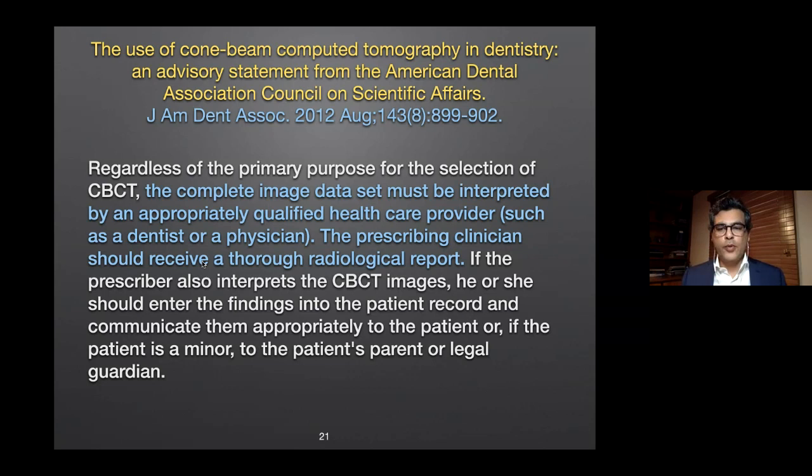So this whole thing needs to be followed as it is. You prescribe a CT scan, you acquire the scan, now you are reviewing it, and then you have to write down the findings, and then you have to convey those findings to the patient or the guardian of the patient if the patient is a minor.